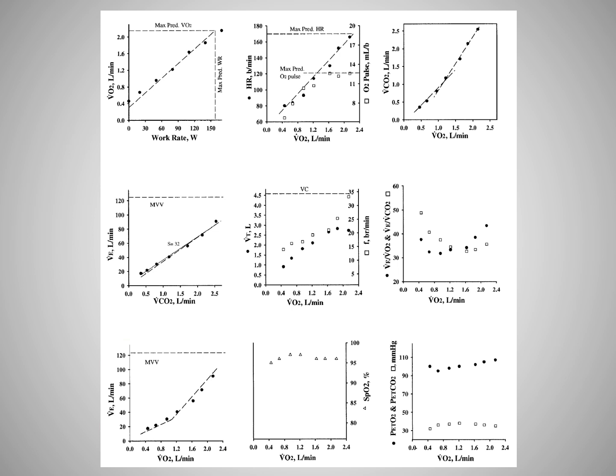With the computer technology available today, and the ability to overlay and manipulate data in so many different ways, I would like to show you how we like to look at patient data, which I feel often makes it easier to understand and to identify AT.